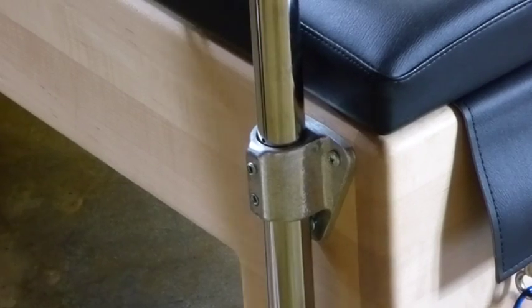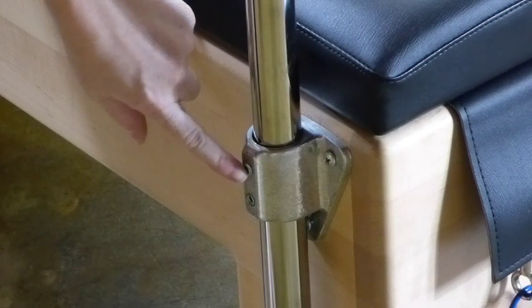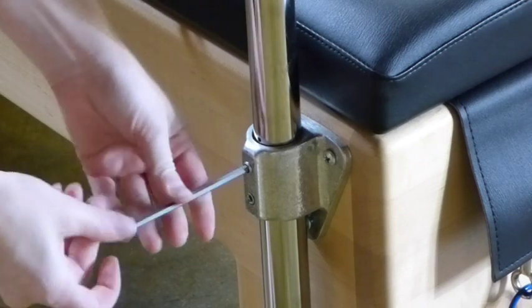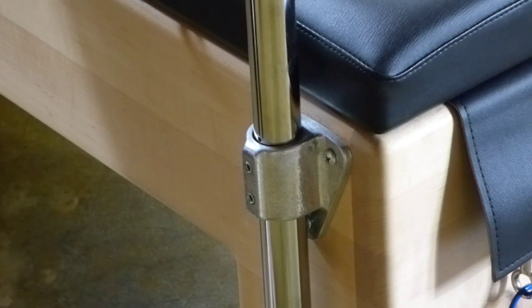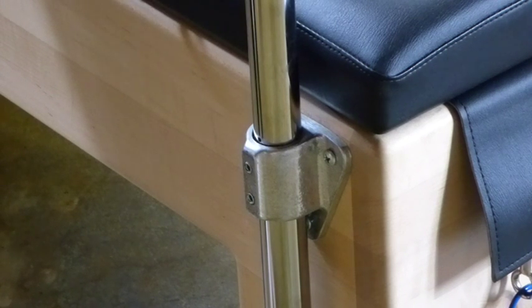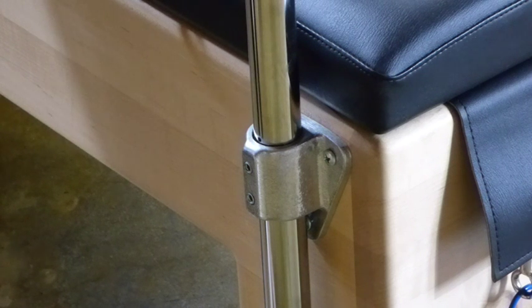The other thing you want to make sure is that all of your set screws on the receivers for your canopy are nice and tight. You can see this one's a little loose, so we're going to take our Allen wrench and tighten it up. It doesn't have to be super tight, but it needs to be snug. Also, make sure that you don't have your cotter pins in anymore. You should be able to see this hole right here, and you shouldn't have anything going through the hole. That's only for installation and setup.